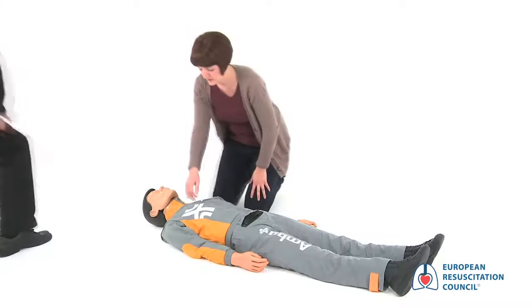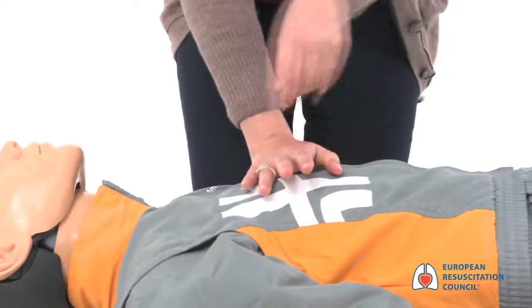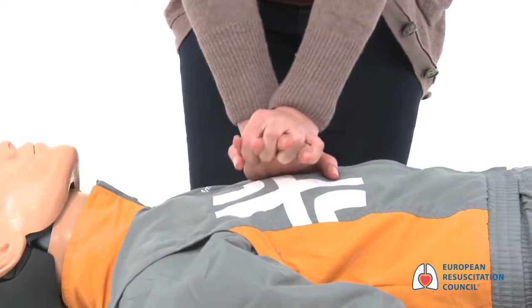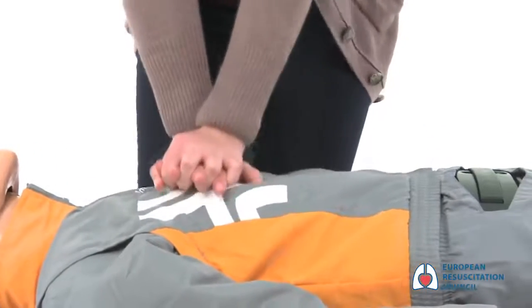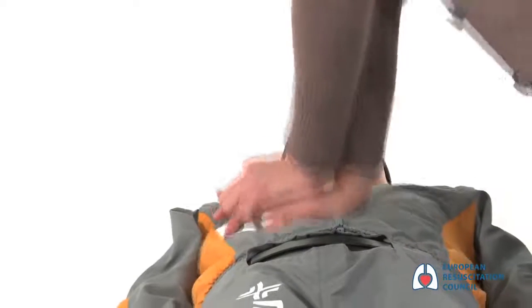Then place one hand in the center of the chest. Put your other hand on top and interlock your fingers. Press the chest down 5 to 6 centimeters whilst keeping your arms straight. Press 30 times at a rate of 100 to 120 a minute, up to twice a second.